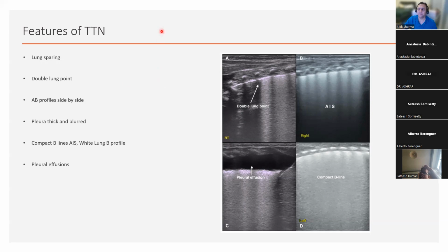Any other questions? No other questions? I have. Yeah, please. Can you hear me? I can hear you. Tell me, please, about again pleural effusion. Is it a distance between two lines of pleura, or no? And if yes, what is the differentiation between hydrothorax, for example, and small hydrothorax, and pleural effusion?